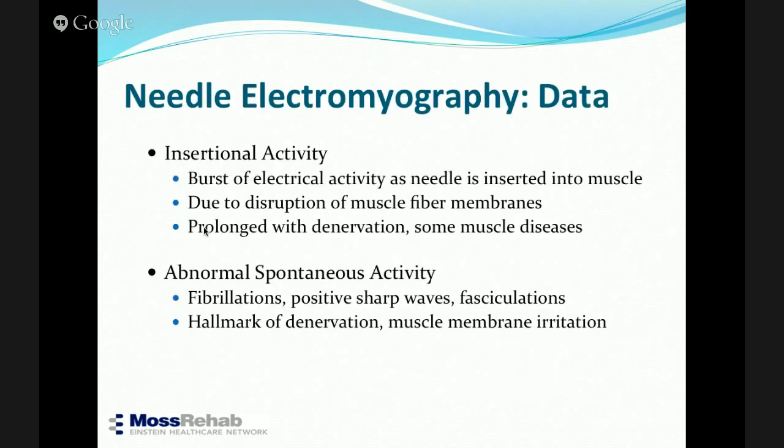So insertional activity is a burst of electrical activity as the needle is inserted into the muscle, due to disruption of the muscle fiber membrane. When you disrupt the muscle membrane, potassium is going to come out and sodium is going to go in, so you're going to have electrical activity. And it's prolonged with denervation and in some muscle diseases.